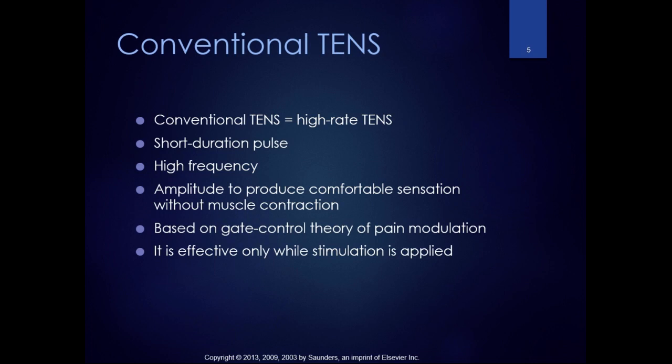The interesting thing about TENS, the landscape of TENS has really changed in the last few years. One of the big companies that manufactured TENS units was called EMPI, and we do have some EMPI units in the lab. They went out of business.